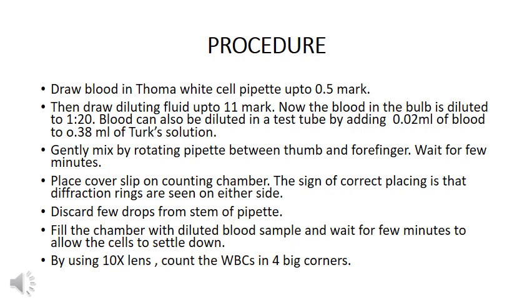With the passage of time you will learn how to make dilutions. With the use of special pipettes, or counted pipettes, we can dilute our blood fluids easily. So it's not a big deal. You can learn it in practice.